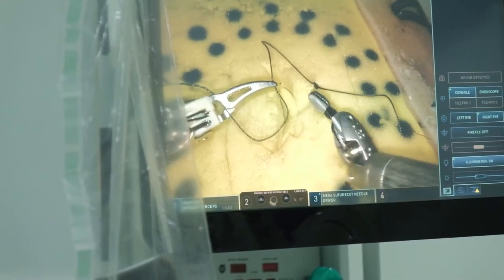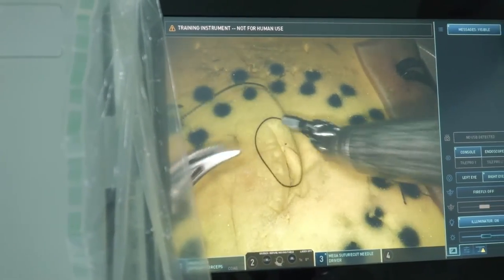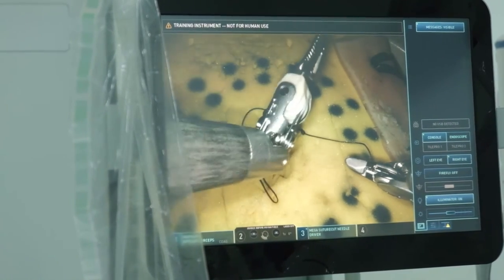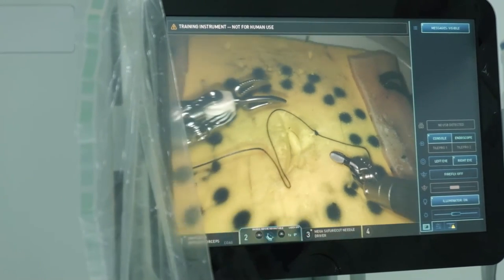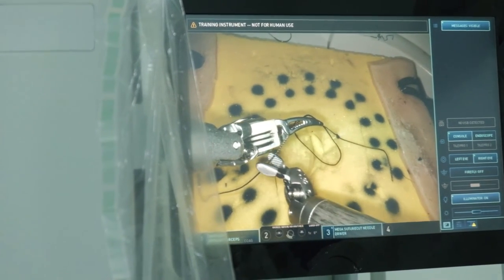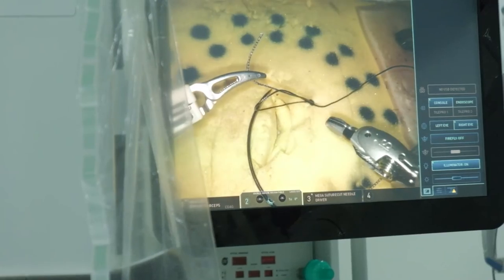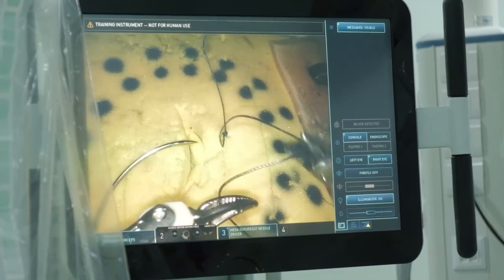You can see the rotation of these robotic instruments, how beautifully you can rotate it in all the directions, and you can see the pulleys and the fine fibers here, which are actually controlling and translating my hand movements into the tip of the robotic instrument. So this is the actual beauty, and rather than the straight stick-like instruments of laparoscopy, we are able to get a much better three-dimensional view, as well as we are able to operate in a much more precise manner.